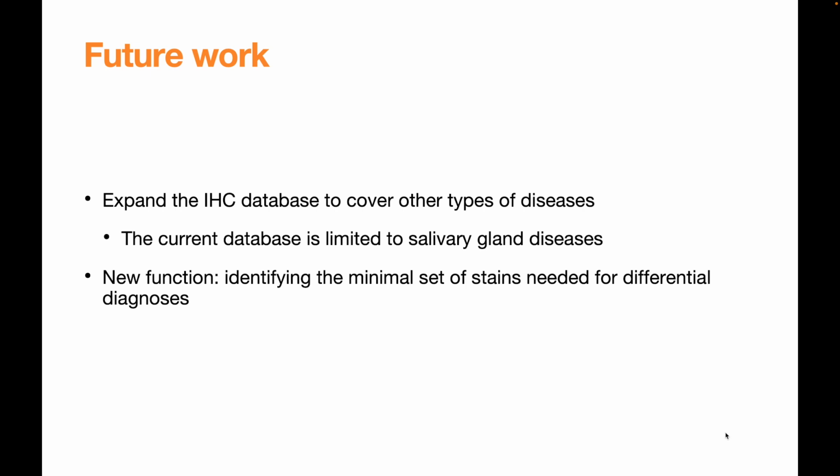If there's more time, I'd like to add a new function. Currently, pathologists may order a lot of types of stains to differentiate diagnoses. So I'd like to add a new function to identify the minimal set of stains needed for differential diagnosis, which will help to save cost.